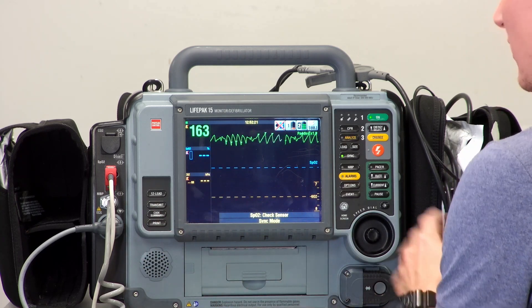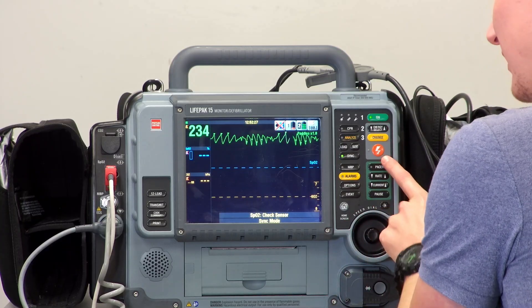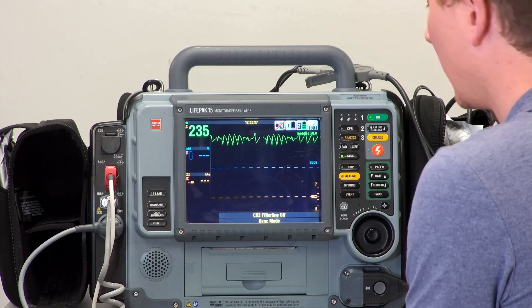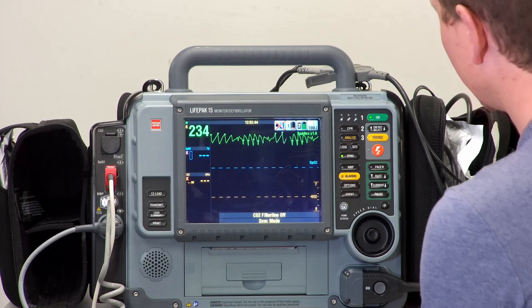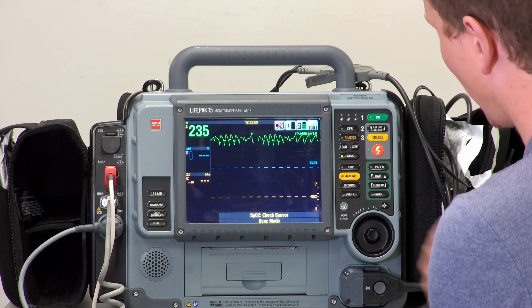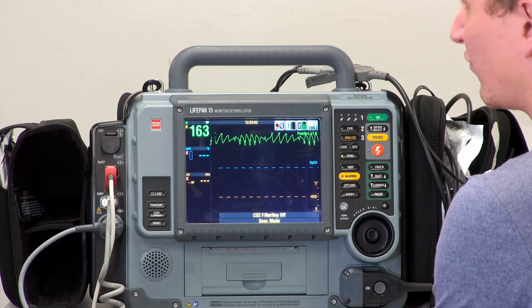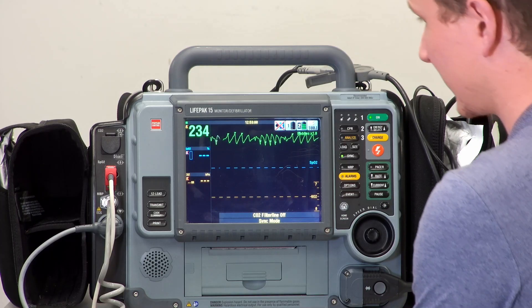The reason sync is important is that we aren't deciding when to shock — the machine is. Therefore we have to hold the shock button down and allow it to choose. Say the patient is clear, and we can now shock. Also consider sedation or analgesia — some morphine or fentanyl — however the patient might be hypotensive and you might not have the blood pressure to give anything for pain. I spoke to someone who was cardioverted without sedation; he said it was really sore, about an eight out of ten, but by the time he realized he was in pain the pain was gone.